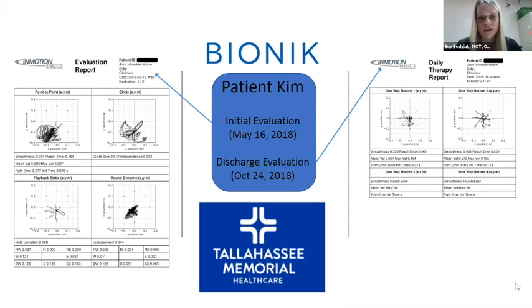Well, by this time, she started to be able to move more. She ended up being able to move her left arm. So this is when we decided, let's try using the robotic arm with her. So we started using the robotic arm, and she's able to get some movement, which was really exciting. So we started to make more goals for her left arm then, and we wanted her to be able to get enough movement where she could use the joystick on her electric wheelchair to be able to drive it. And also feeding goals, we were able to get her set up with feeding.